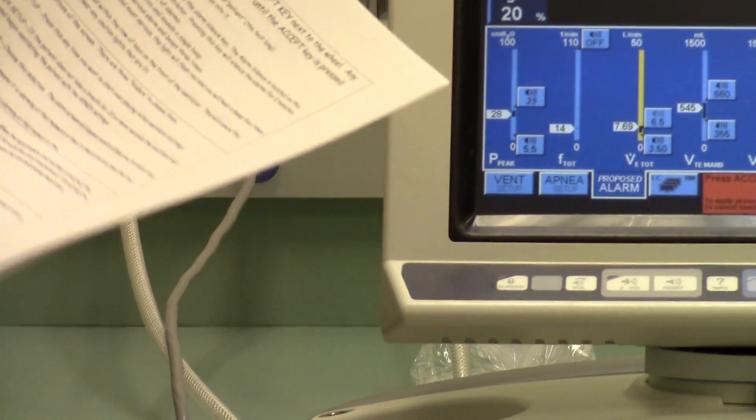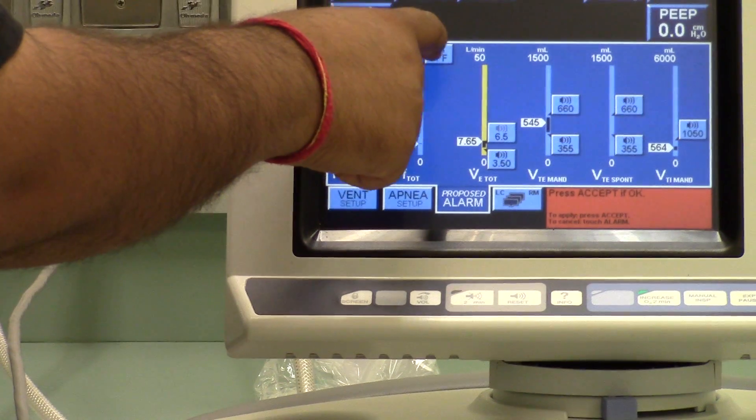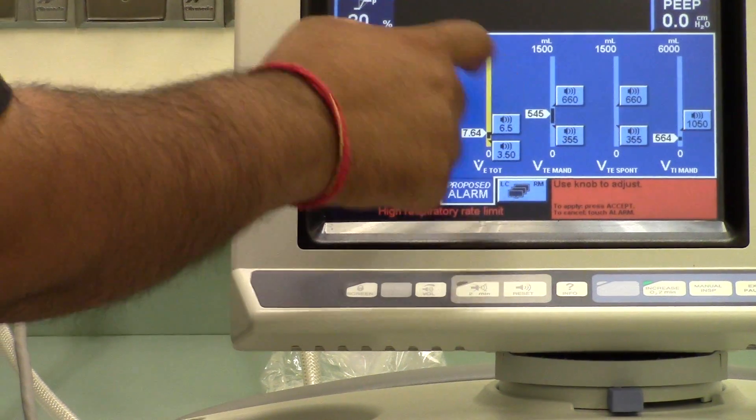Our high respiratory rate, which is our F total, we set at 25.